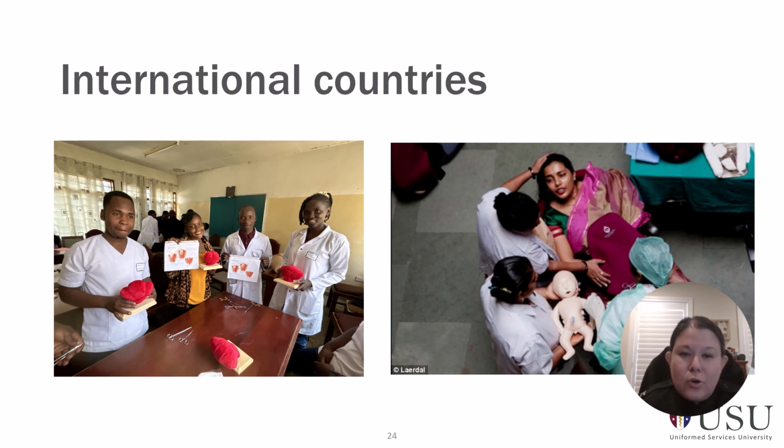This just takes a chromic stitch, which is inexpensive and available, and we can potentially prevent people from needing a hysterectomy. So this is us practicing, and this is a fairly low-tech model that I just made. I kind of sewed a uterine pillow and stapled it to a wooden base, and then filled it with stuffing, batting, and we were able to practice our B-Lynch sutures on a very low-cost model and practice that skill.